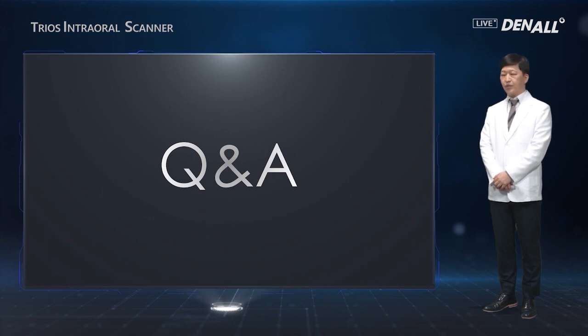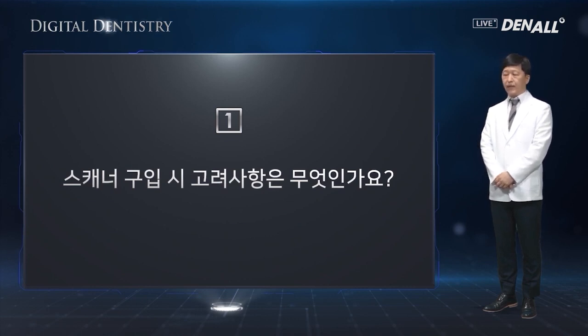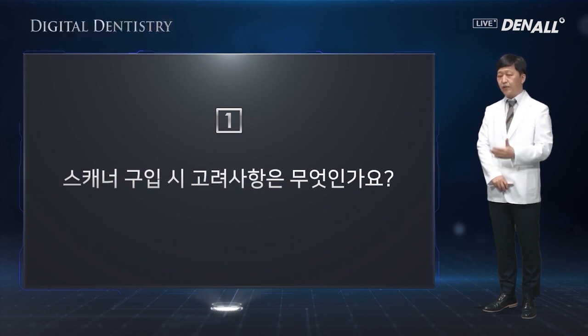Q&A. First question. What needs to be considered in purchasing an intraoral scanner? Many people, when they purchase a scanner due to economic reasons, tend to choose a low-priced one. The most important thing when it comes to purchasing a scanner is not just considering the scanner itself, but you need to think about how you are going to use the CAD software for the designing.